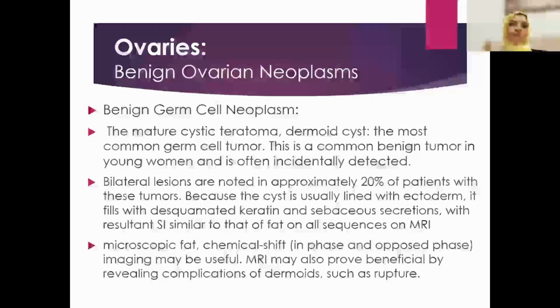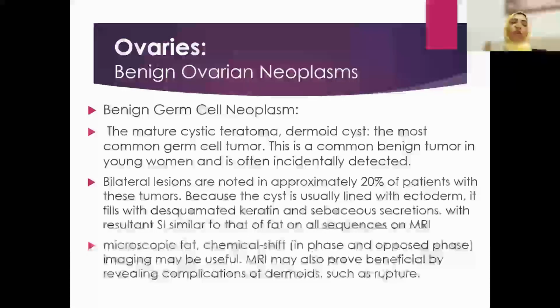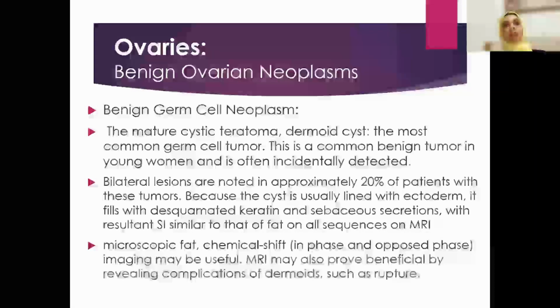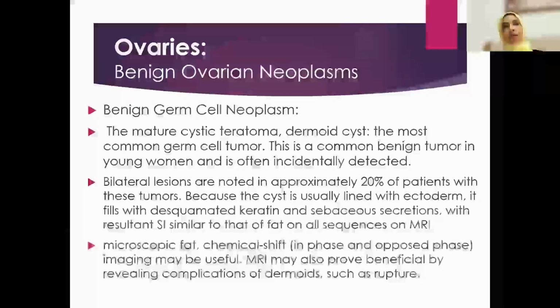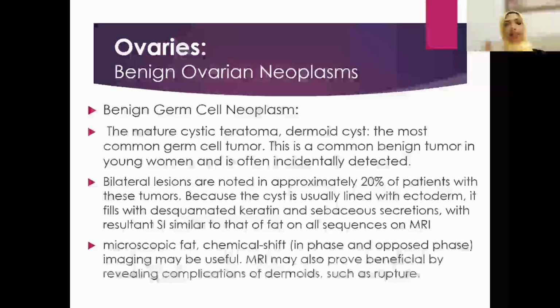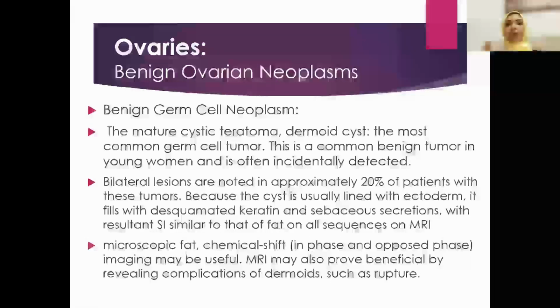It's a mixture of tissue, but we definitely love to see the fat, which is diagnostic of that kind of tumors. The fat could be macroscopic, so it's hyperintense on T1, and definitely couple it with T1 fat suppression to make sure it's getting suppressed and it's not blood.